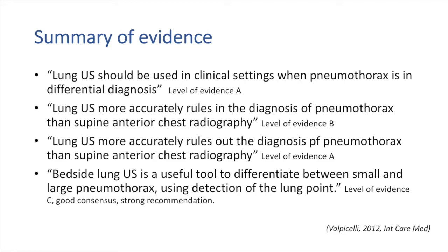To summarize the evidence on the lung ultrasound, it can be used in clinical settings when pneumothorax is in differential diagnosis, meaning critical care and emergencies. Lung ultrasound more accurately rules in and rules out the diagnosis of pneumothorax than supine anterior chest radiography. And lung ultrasound is a useful tool to differentiate between small and large pneumothorax using detection of the lung point.